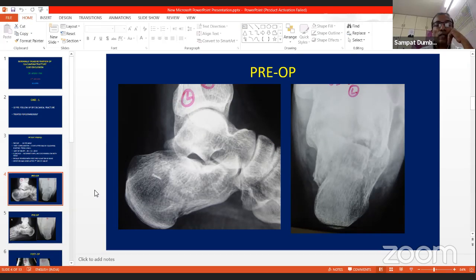Okay, so very good case. We should do adequate to the calcaneal fracture. I always tell 3 things: consider injury, consider patient, and consider surgeon. Now, since sir has done it 10 years back, he has absolutely done it up to the mark. So just do adequate.